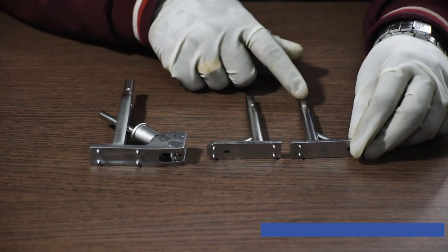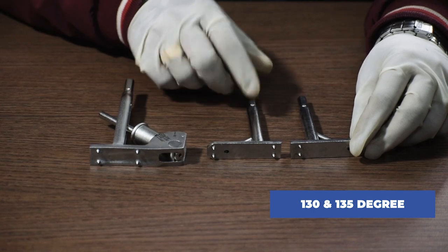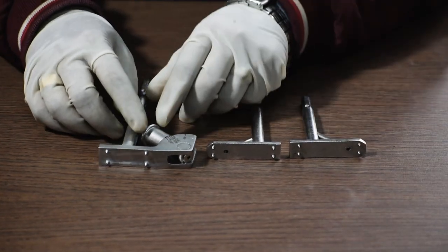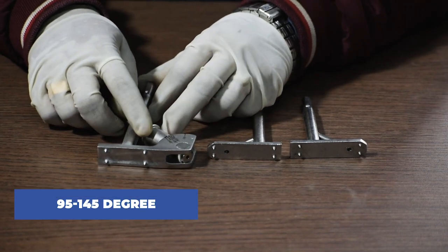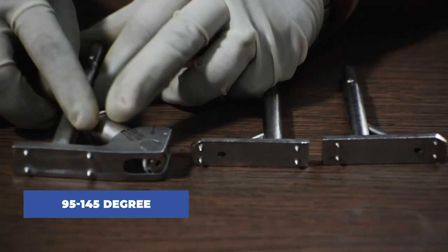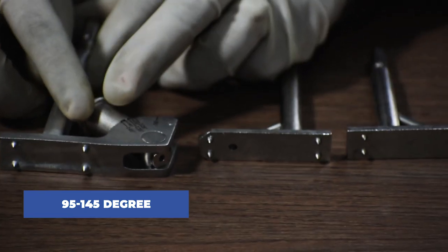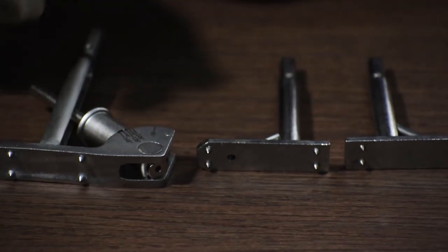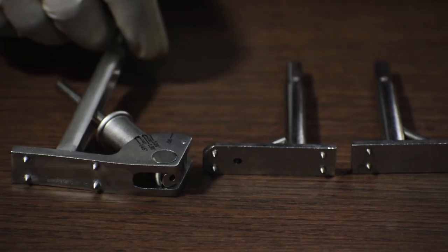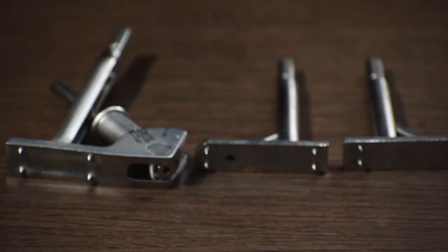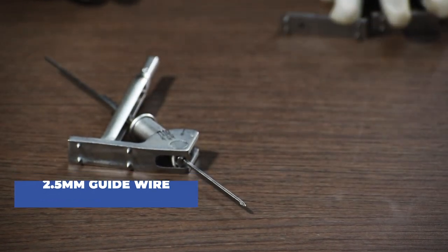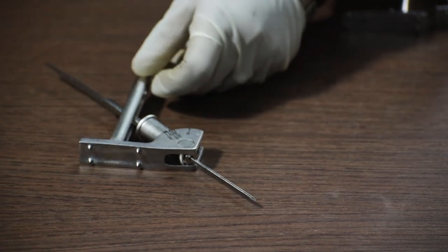Fixed Angle Guides are available in 130 and 135 degree. For Variable Angle Guides it ranges from 95 degree to 145 degree. Starting from 95 degree then 130, 135, 140 and 145 degree respectively. It is mentioned in the surface of the Angle Guide. The purpose of the Angle Guide is to help us insert the guide wire in a particular angle required for the surgery.